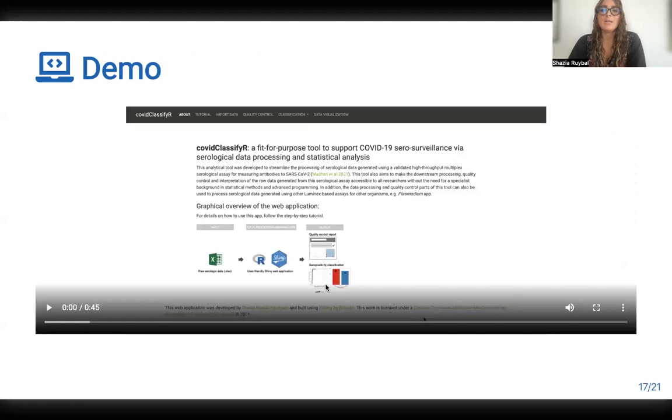All right. So finally, just to finish off this section, I wanted to show you a demo of everything. I know I've shown you little bits, but now we're going to go from start to uploading data and checking the plate layout. So I'll narrate again as we go. See if I can do this.